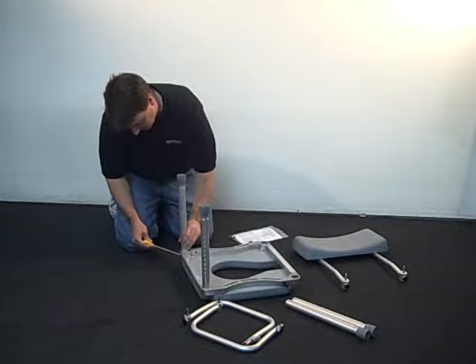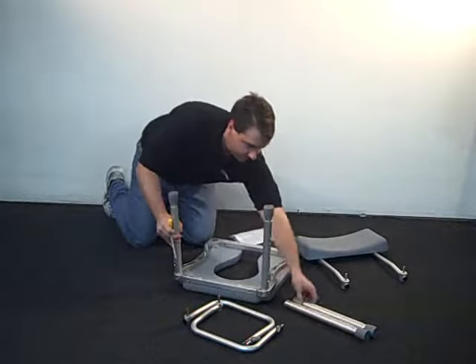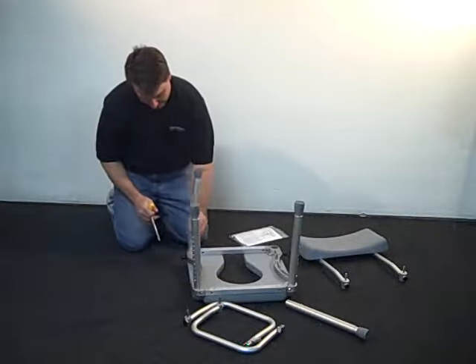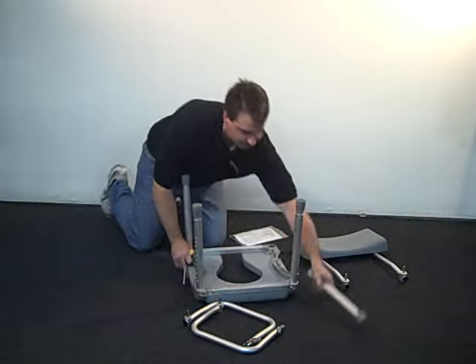Use the included quarter-inch Allen wrench to tighten the bolts located at the corners of the frame. For ease of future leg height adjustment, position each leg in the sockets so that the adjustment holes face outward.